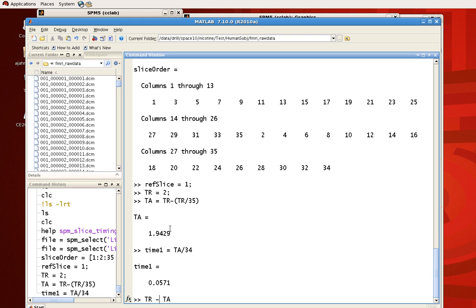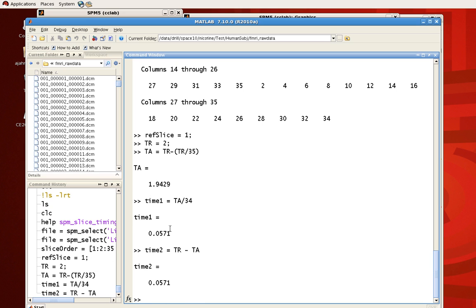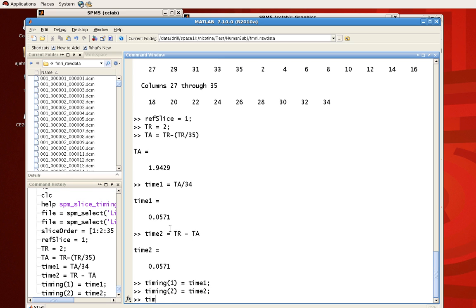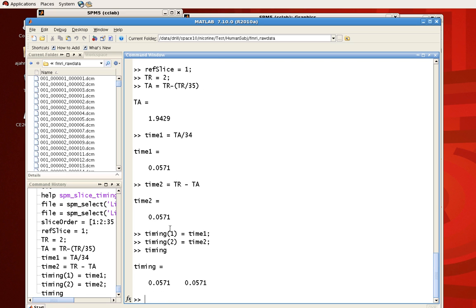So let's assign that to time2 because it's going to be in the second element of the time vector. And again, this is 0.0571. So we can go ahead and say timing[1] is equal to time1 and timing[2] is equal to time2. Now, if we just look at timing, we see that there are two elements in it and 0.0571 is in both of them. So that's all we need.